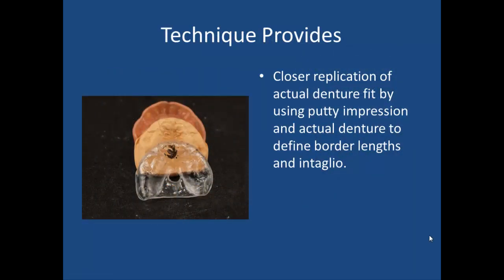As you can see here, this is an illustration of a case I did: an immediate denture, then a putty model made off the finished denture, and then the stent itself. This technique, because I'm using the actual denture to form the stent, provides much better accuracy. It's a mimic of exactly all the border lengths and contours on the inside.